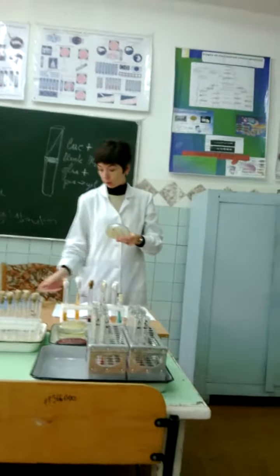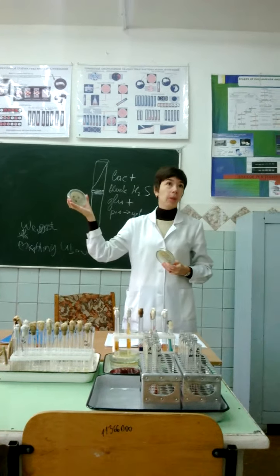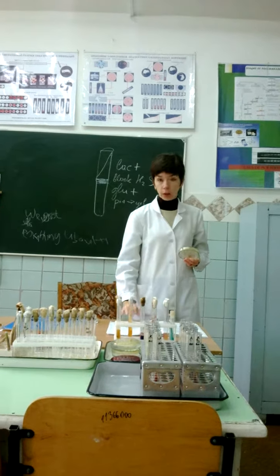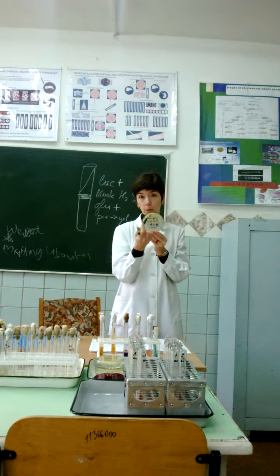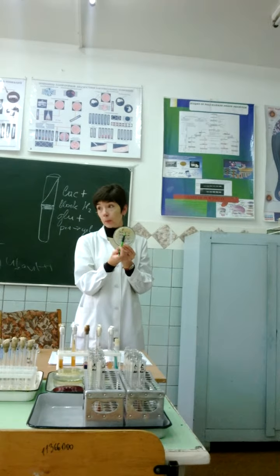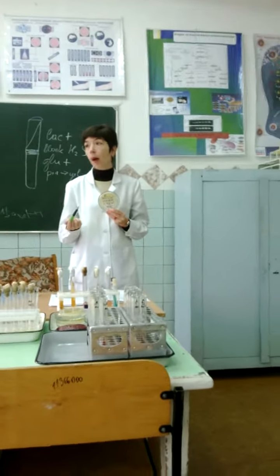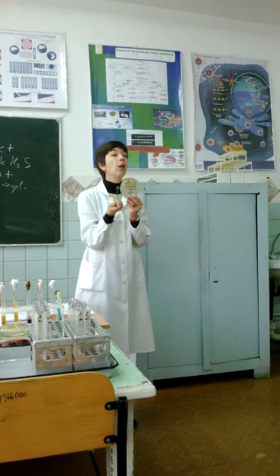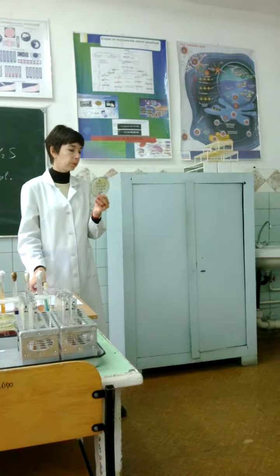For example, if it's a hospital infection, or a complication after surgery, Staphylococcus aureus, nosocomial infection, we try to find where the source of infection is. Take material from patients on one petri dish, from nurses on another, from poorly sterilized instruments on another. Isolated bacteria are spread to cover the whole petri dish. Then mark the bottom of the dish and add typical bacteriophages, standard preparations present in the laboratory, to each. Cultivation takes 1 day. After 1 day, we check the results: which bacteriophage lyses this bacteria, what phagotype this bacteria is. The phagotype is the number of the bacteriophage which lyses the bacteria.